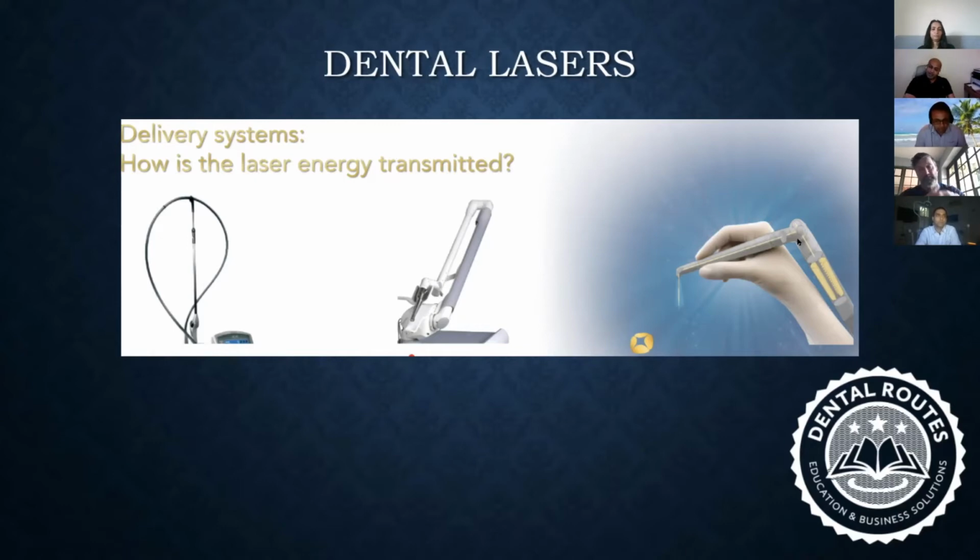And the bigger advantage with this particular mechanism is this whole piece can be detached very easily and put in a box and posted off. So all you need is someone to send you another handpiece, and this one goes away, and they can take maybe 5 months to repair it and send it back to you. It doesn't matter to you because the next morning you have something in your practice to carry on working. Because for us dentists, the most important part is to make sure that we have continuity of care.